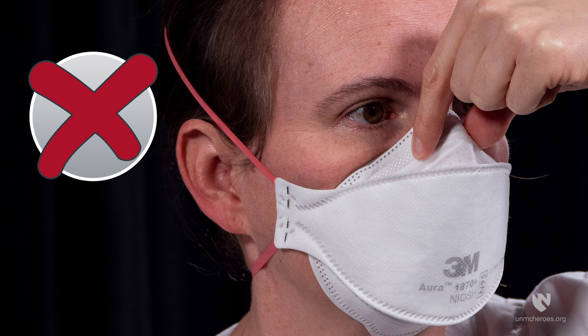Pinching the nose piece with one hand may result in improper fit and less effective respirator performance.